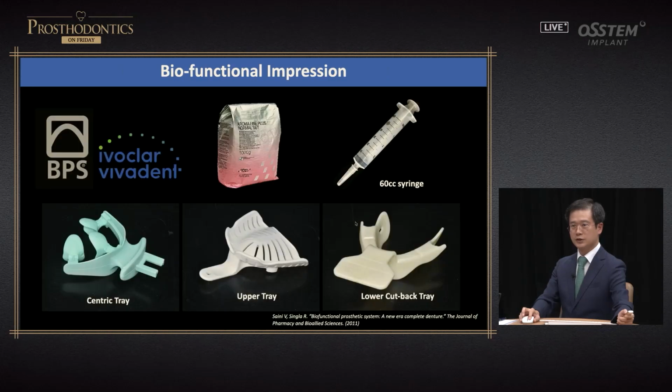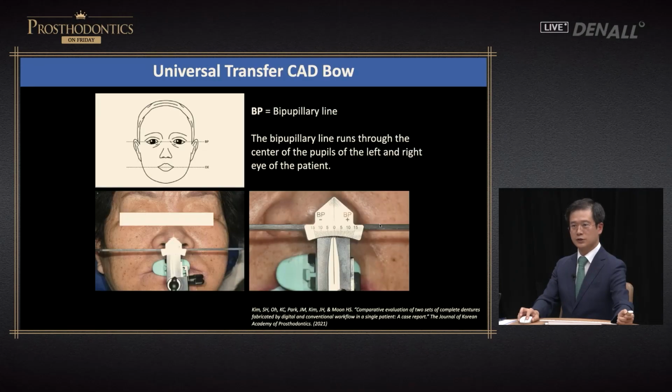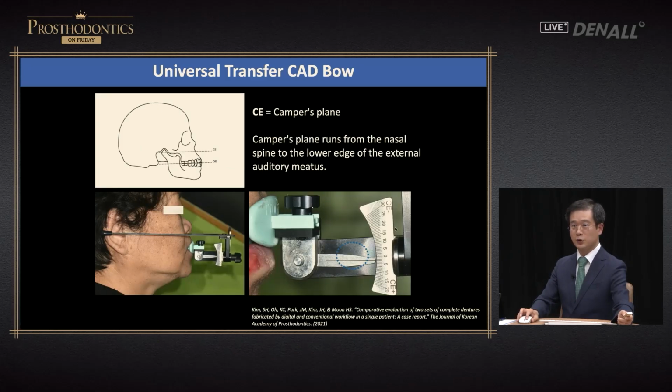This is how I take impression. I use a cutback tray to take impression with the patient's mouth closed. Bite is taken like this. This kind of appliance is used. This appliance is like a face bow.